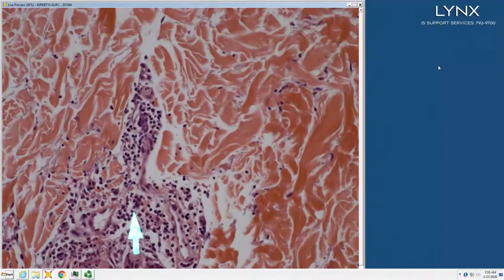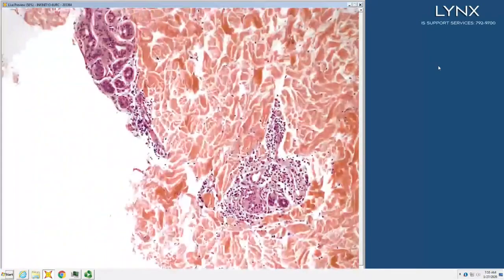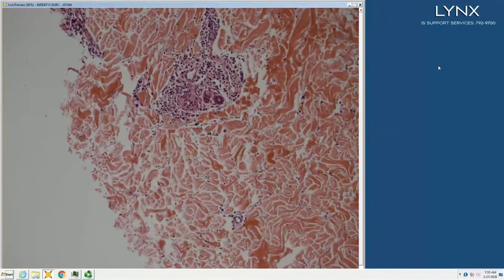So what kind of neutrophilic eccrine hidradenitis could this be? Are you describing like a blast? Yeah, probably in the setting of leukemia, right? And you've got some recruited atypical lymphocytes that you're seeing, or atypical, actually, myeloid cells with that rim of cytoplasm. So you're seeing some recruited atypical myeloid cells in the infiltrate as well as neutrophilic eccrine hidradenitis.